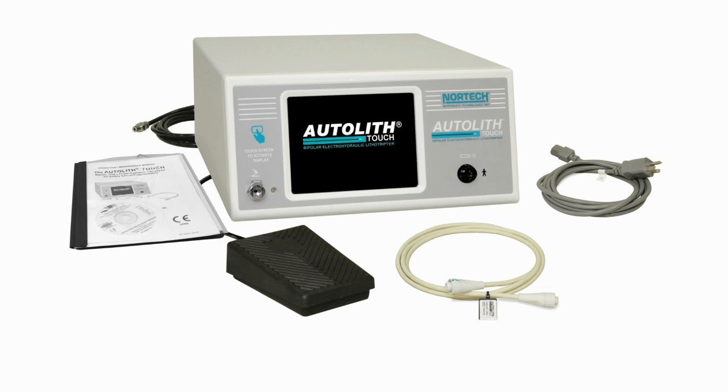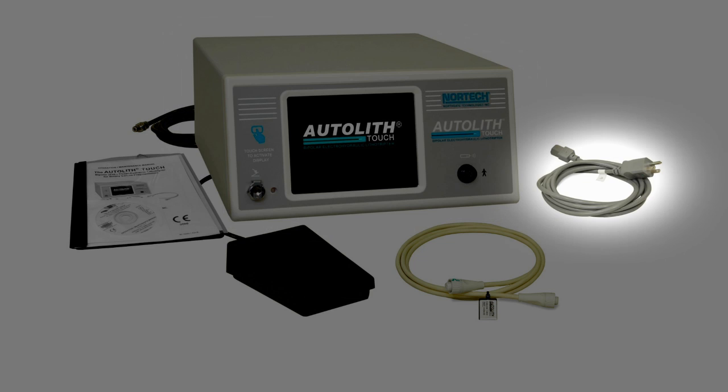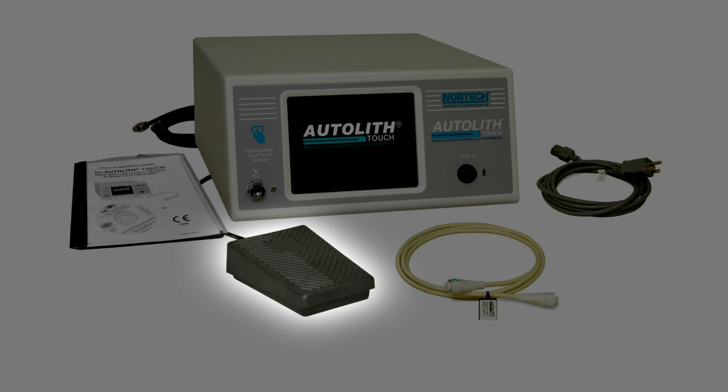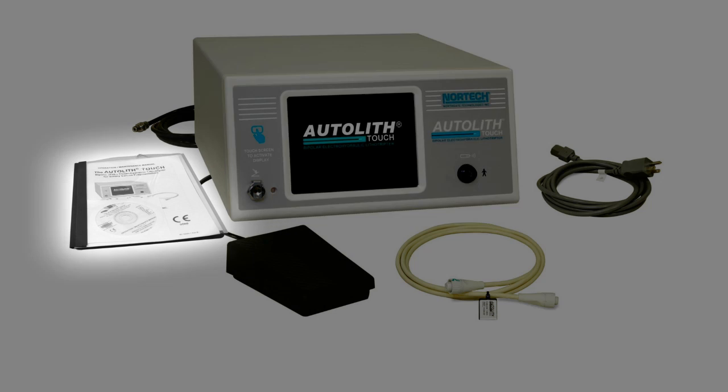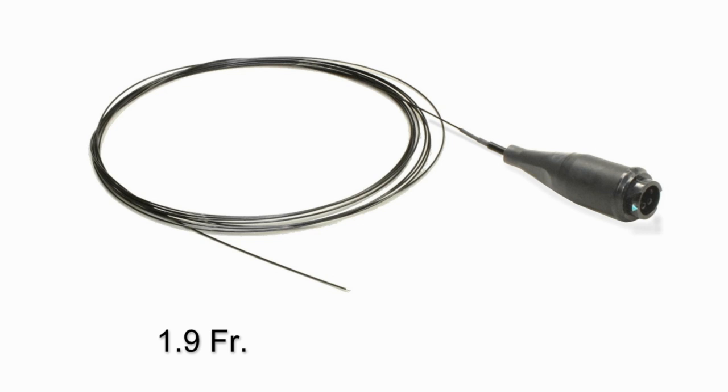The Autolith Touch lithotriptor comes complete with all the required accessories. The generator unit, power cord, extender cable, foot pedal, and operator's manual are seen here. The 1.9 French, 375-centimeter, single-use, disposable probe was developed specifically for use with the Spyglass system. These probes are purchased separately when needed.